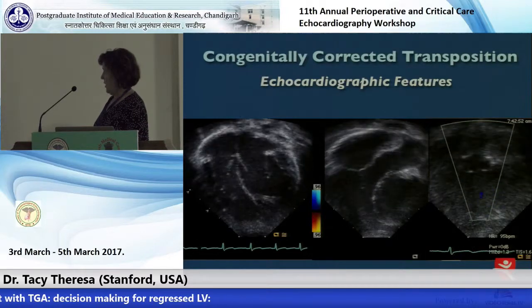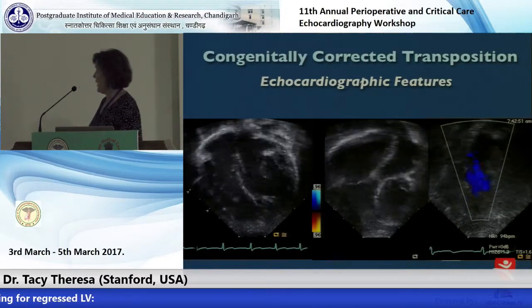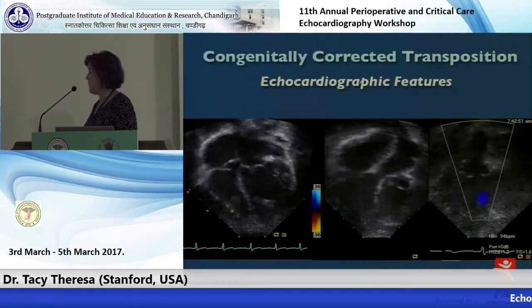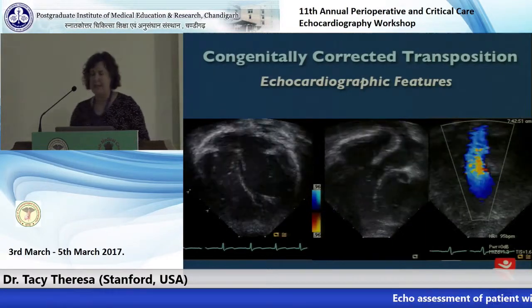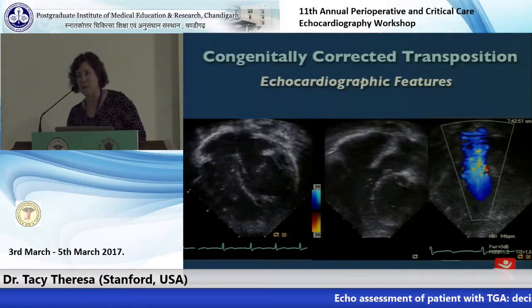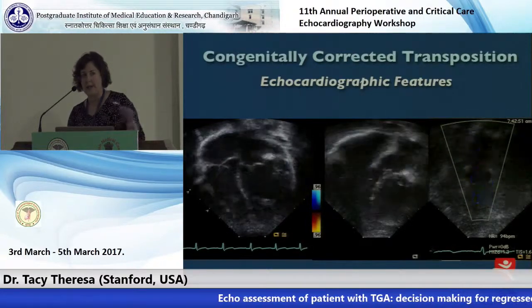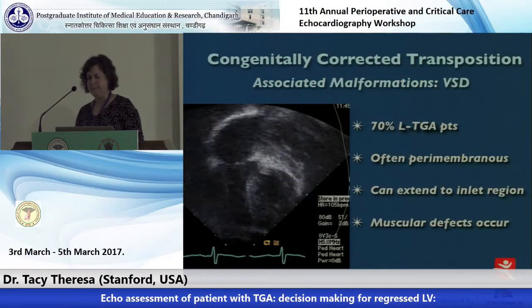All right, and in here, as we come more anterior, the first vessel we encounter is the pulmonary artery. Here we see it's bifurcating. So the pulmonary artery is posterior and coming off that morphologic LV, and then coming a little bit more anteriorly, we see the aorta anterior and leftward. That's often sometimes your first clue that you have an L transposition, is that the aorta is anterior and leftward, which it never is in almost any other case.